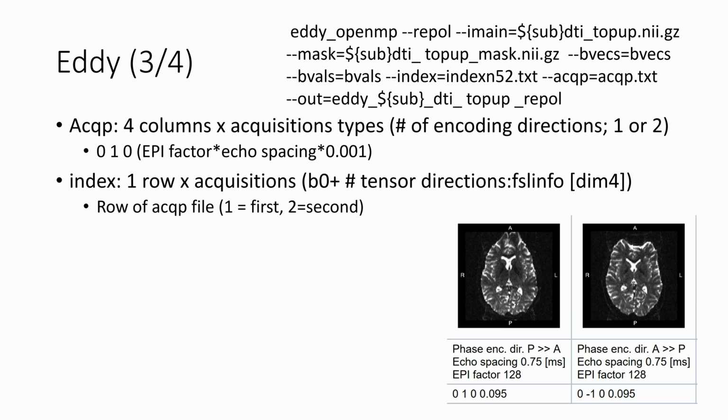They might be thinking, why am I having to keep on doing the resting state? Or, wow, this is really exciting. This is my first time doing a resting state and looking at a fixation cross. Life could not be this good all the time. Or whatever people think, I'm just assuming. So in those cases, you collect a mapping of the gradient one way, gradient the other way, and you build up that top up.